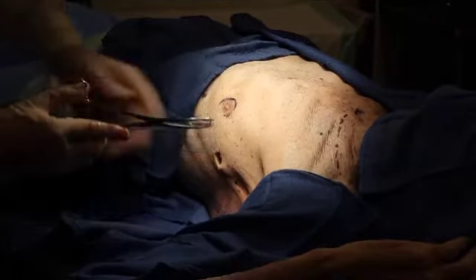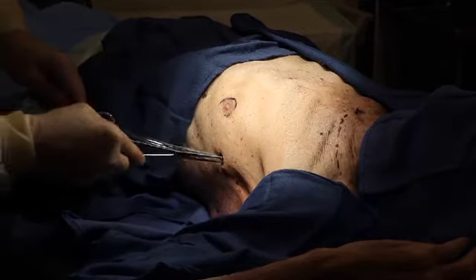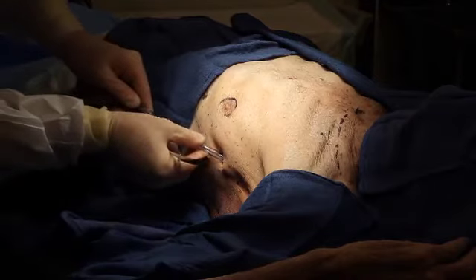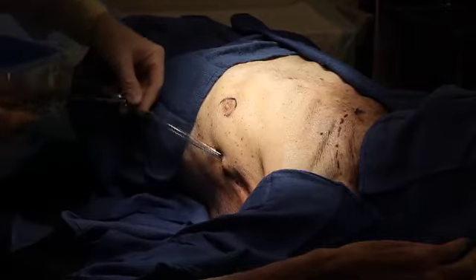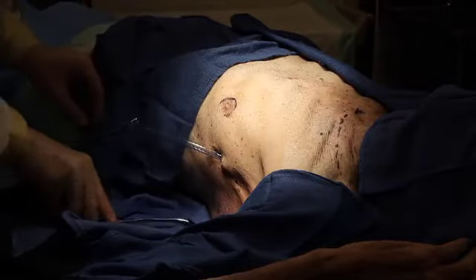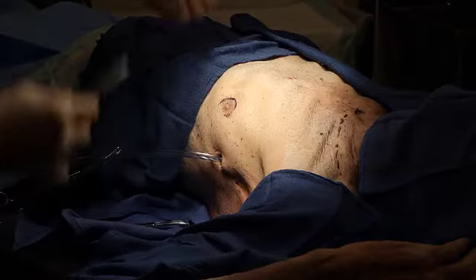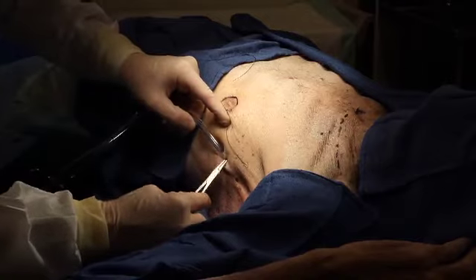A clamp placed on the tip of the tube may aid with placing the tube into the chest, and another clamp placed on the opposite end of the tube will prevent blood in the chest from draining onto the bed or floor. Fogging of the chest tube with expiration, air movement, or drainage of fluid from the chest suggest successful placement of the tube in the pleural space.